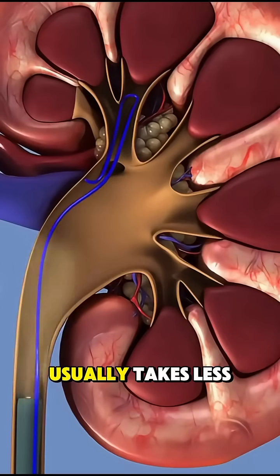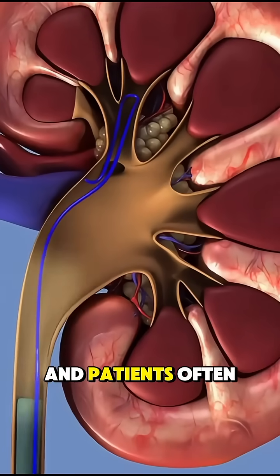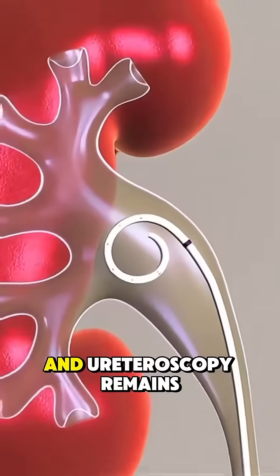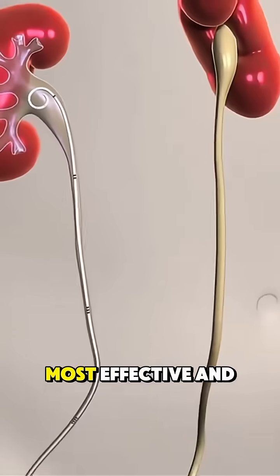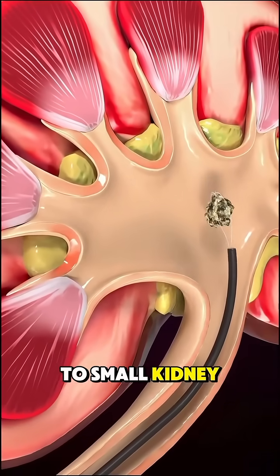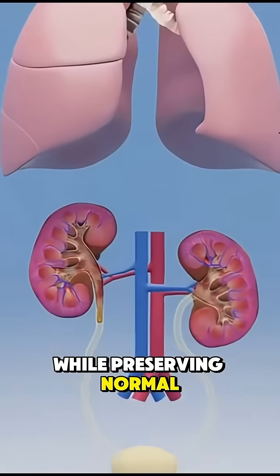The entire surgery usually takes less than an hour, and patients often return home the same day. With no incisions, recovery is quick, and ureteroscopy remains one of the most effective and safest methods for treating medium to small kidney stones while preserving normal urinary function.